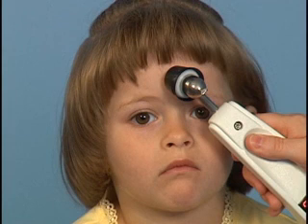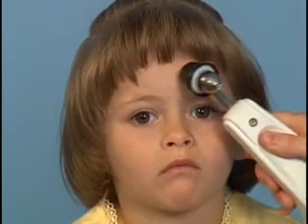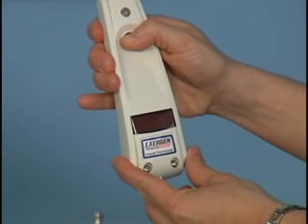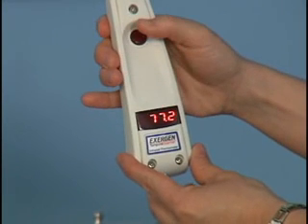Depress the scan button and keep it depressed the entire time you are scanning. Slowly and gently slide the probe in a straight line across the forehead, halfway between the eyebrow and upper hairline. Don't lift the probe away from the forehead and keep the probe flat against the skin. Keep moving until you reach the hairline. If you don't keep the scan button depressed, or if you scan too quickly, the temperature reading may be falsely low.